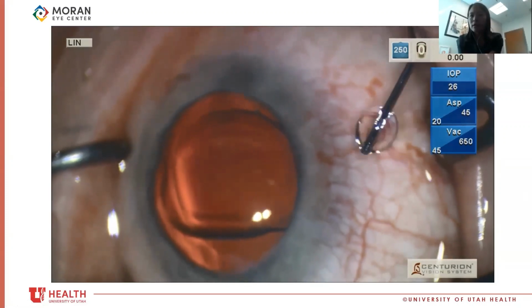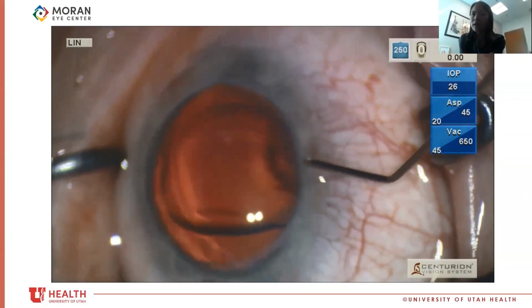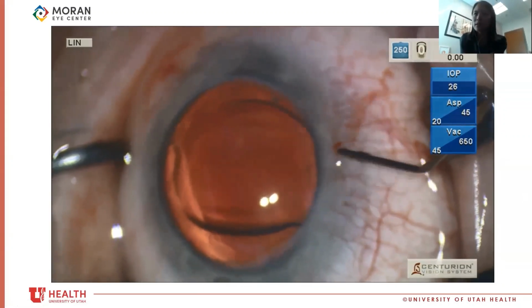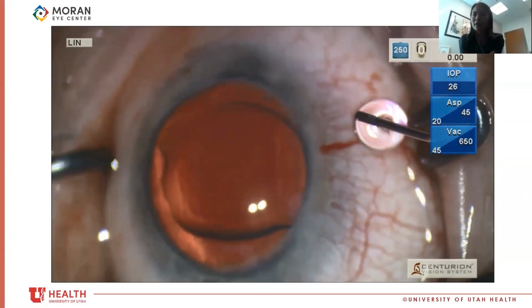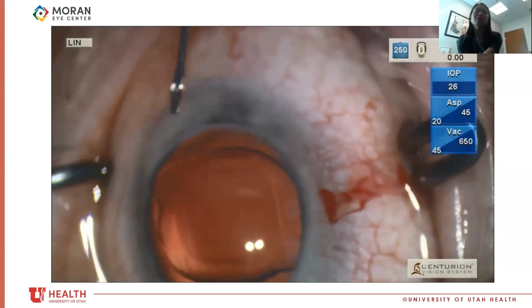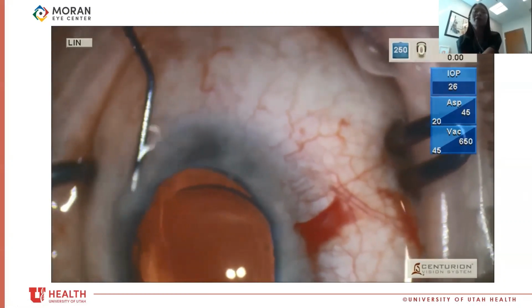And I think, is that what I think it is? Did I just put BSS and cause a Descemet's detachment with BSS? So I'm in disbelief, so I do it again, and I make the wave even bigger. Now it's got a big giant Descemet's detachment, kind of underneath stroma.